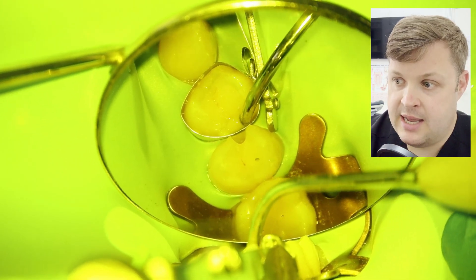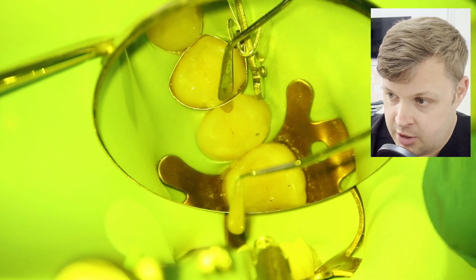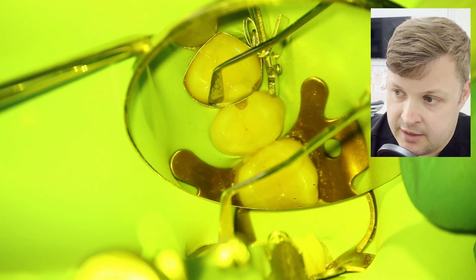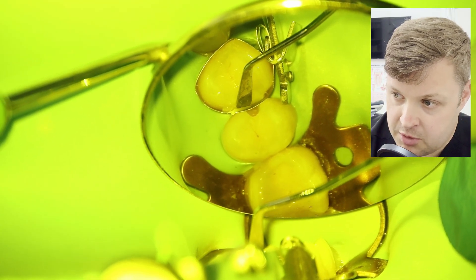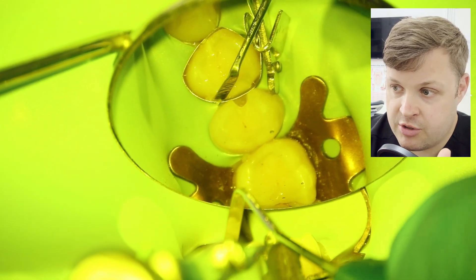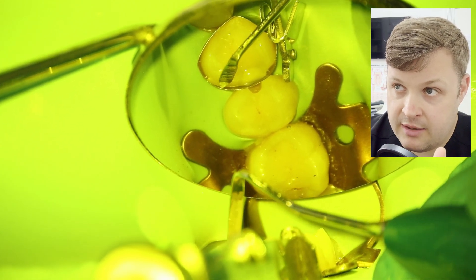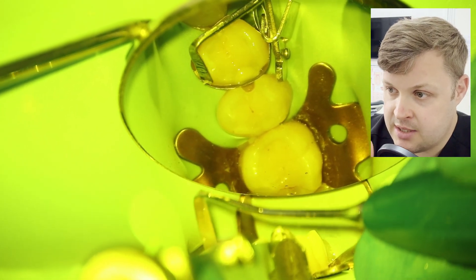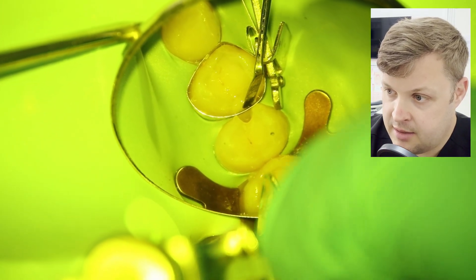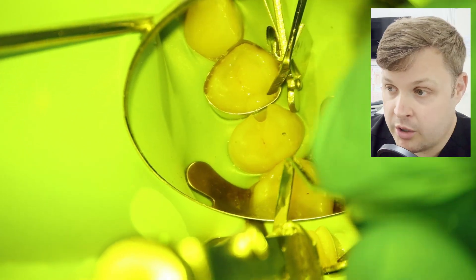Keen-eyed viewers might say I've placed a larger bulk of composite, but it's such a small filling. The C-factor is something we need to consider, but when I remove the matrix band I'll be able to cure the surface where the band was sitting. I'm happy this isn't too much composite to cure in one go.